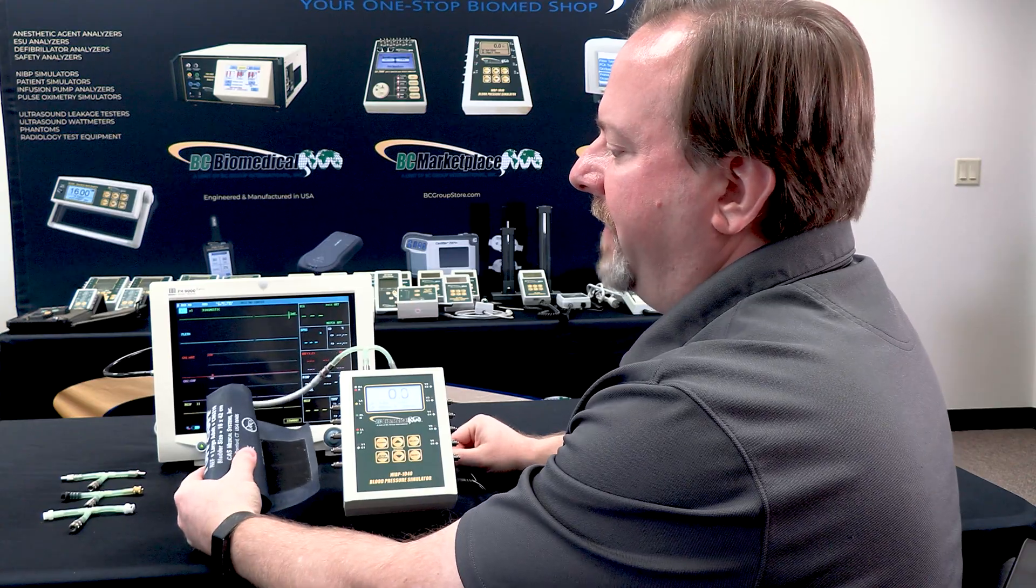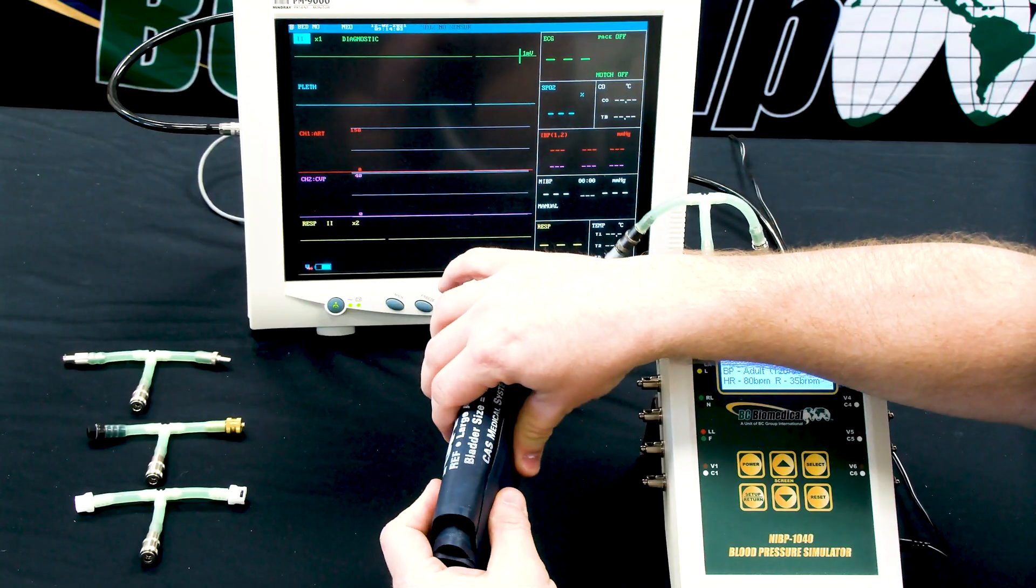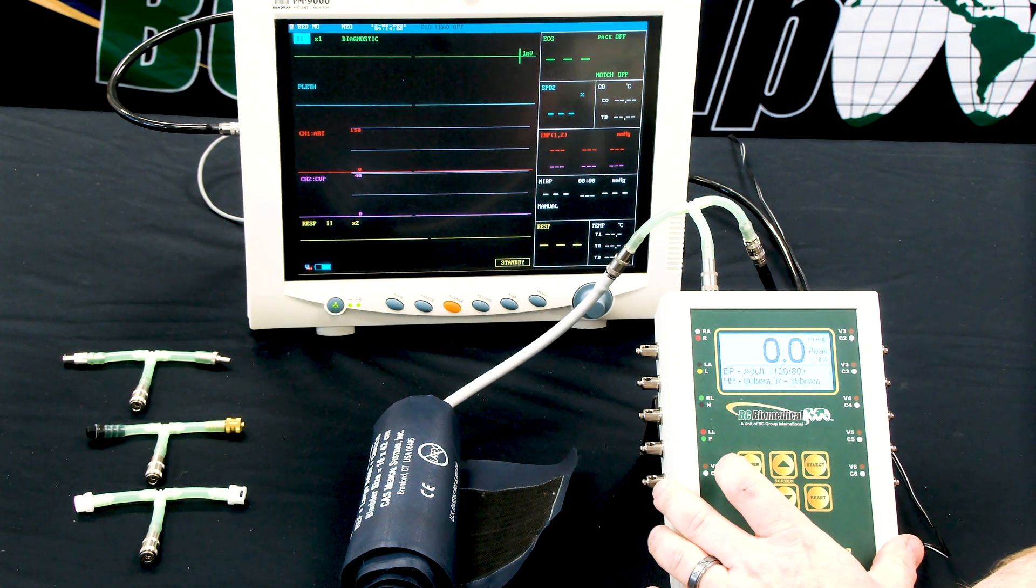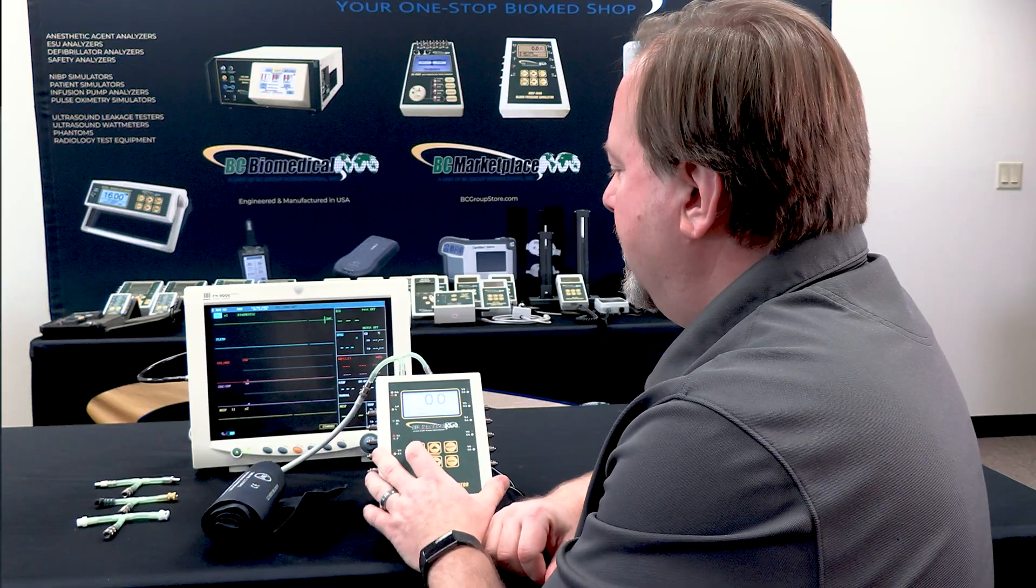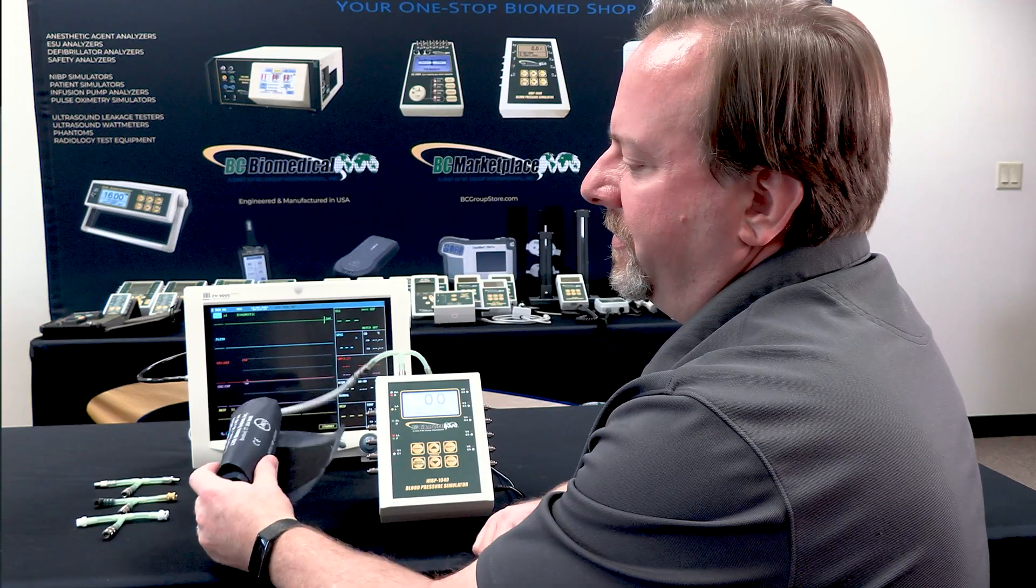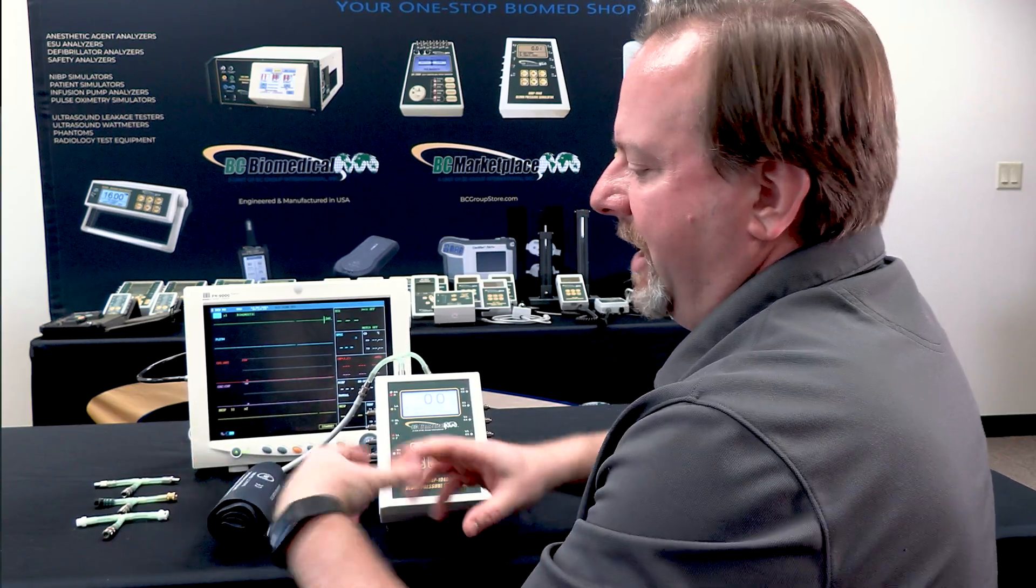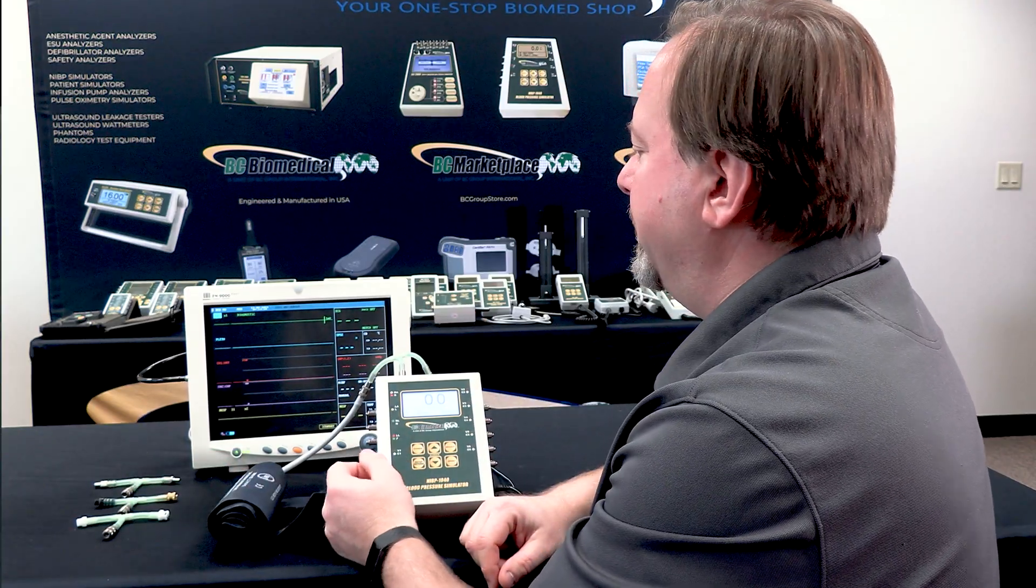It's important that the cuff be wrapped tightly, either around itself or around a firm cylinder, either a water bottle or something of that size that will reduce the volume inside the cuff. If we just leave it unrolled, it'll have too much volume and the monitor won't get a good signal.